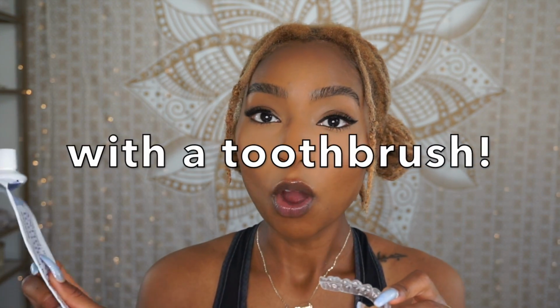When I take them out in the morning, I just brush my liners, the inside and the outside of them, with my toothpaste. I get it all sudsy. I do that first thing. I don't let them sit in morning breath or food or whatever the case may be. I clean them right away.